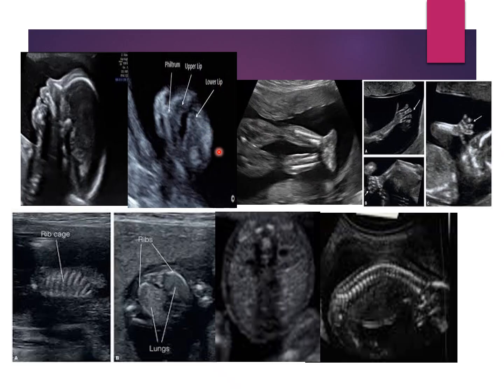Then we'll look at extremities. Now around 11 weeks, we start to get what's called ossification, which means these bones are going to be brighter. They're not going to be shadowing yet like we would expect in an adult bone, but they're going to appear brighter so that we can see them. They've ossified.